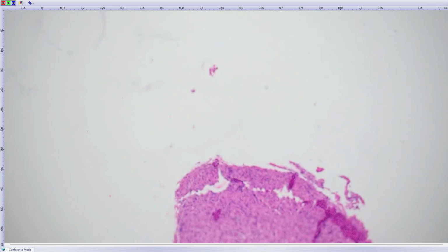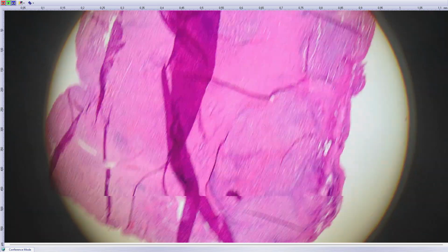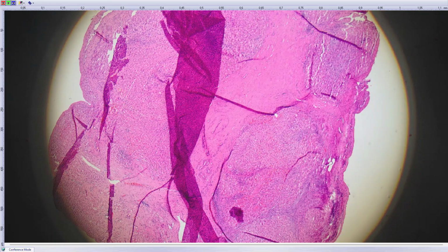So endometrial polyp is a 2-second diagnosis, okay, but you should always go through the surface of the polyp to rule out serous carcinoma. It usually metastasizes through fallopian tubes. It doesn't have to invade anything. Yeah, I saw a case with 2 glands only positive for serous carcinoma, and it killed the patient. So it's important not to miss the diagnosis in the polyp. You have to always very carefully go through the whole lesion.